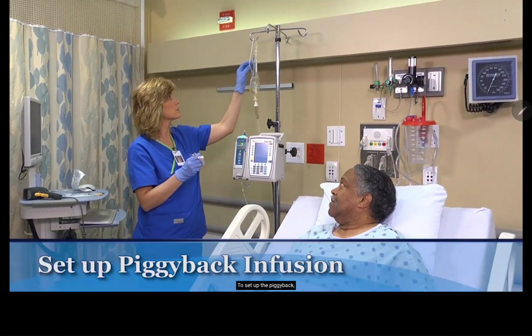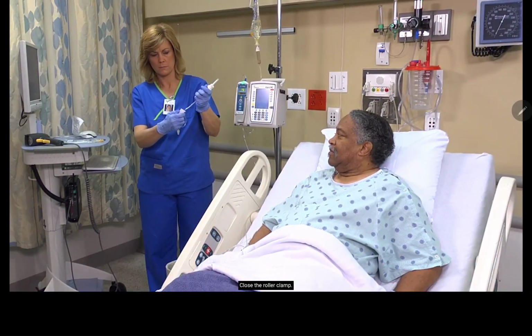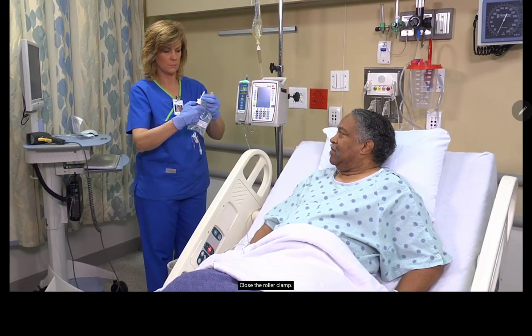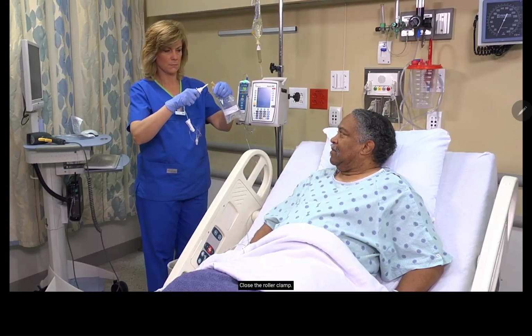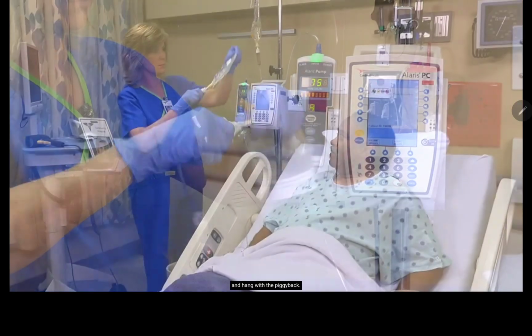To set up the piggyback, remove the secondary infusion set from the packaging. Close the roller clamp. Insert the spiked end of the tubing into the medication bag and hang the piggyback.